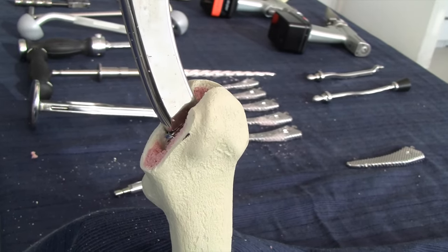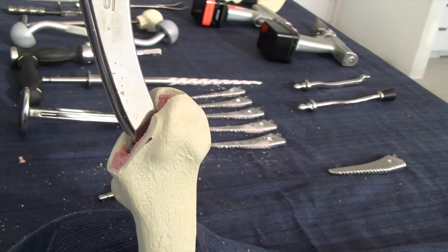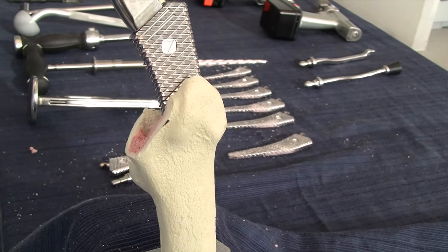The femur we are working with today is quite large. We knew we were going to have to progress through the system to achieve proper press fit. We found the number seven to be the appropriate size.